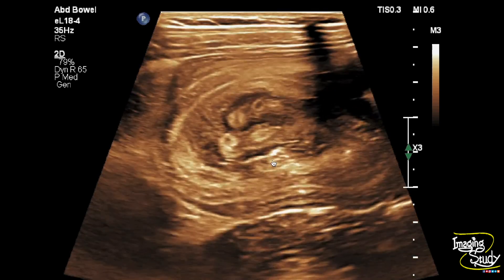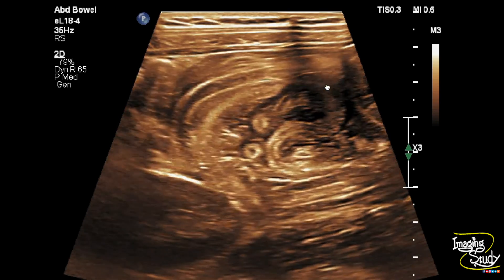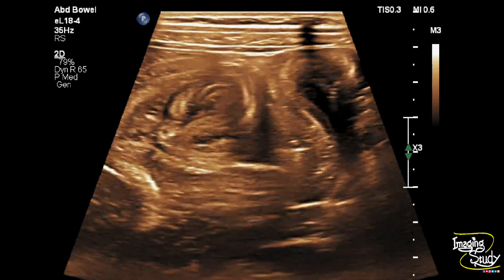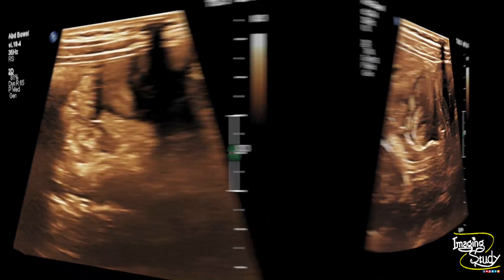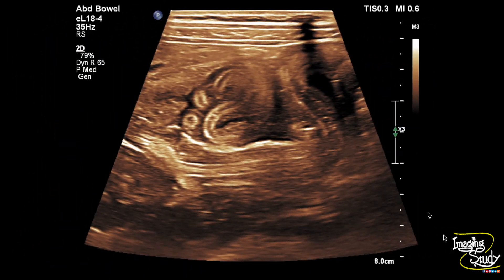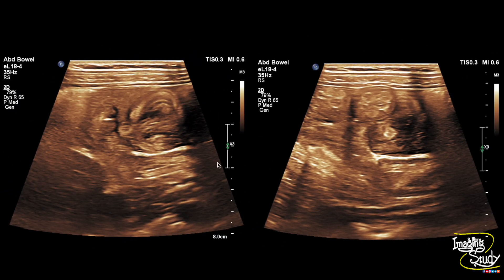You can see on cross section they appear round in shape. Here's a picture where you can see snake-like structures within the bowel lumen. And in this picture you can still see these hyperechoic worms within the bowel lumen, in longitudinal section and cross section.